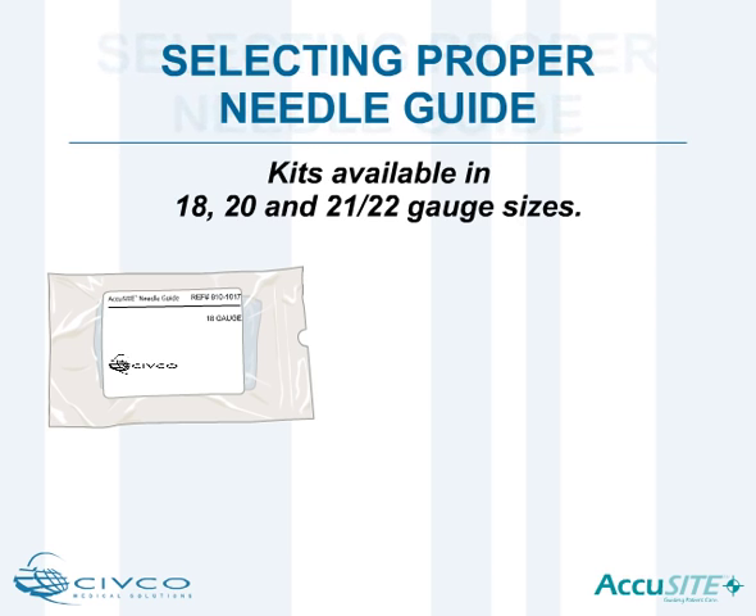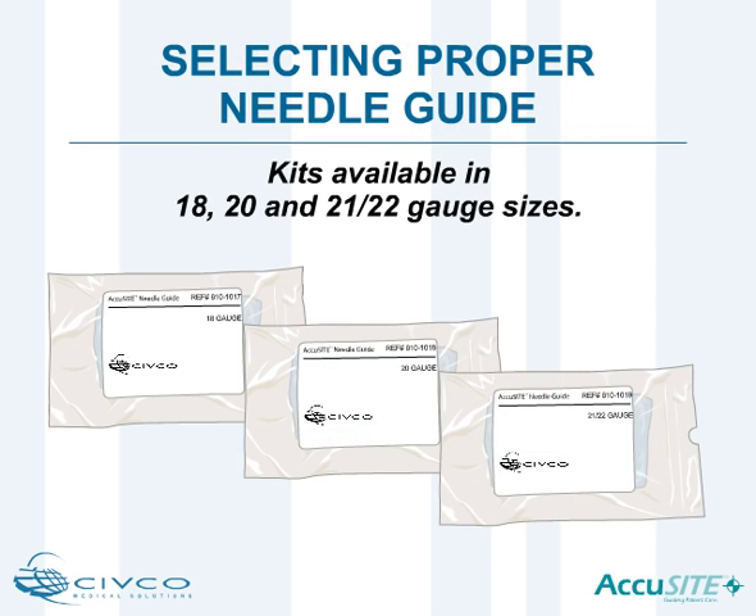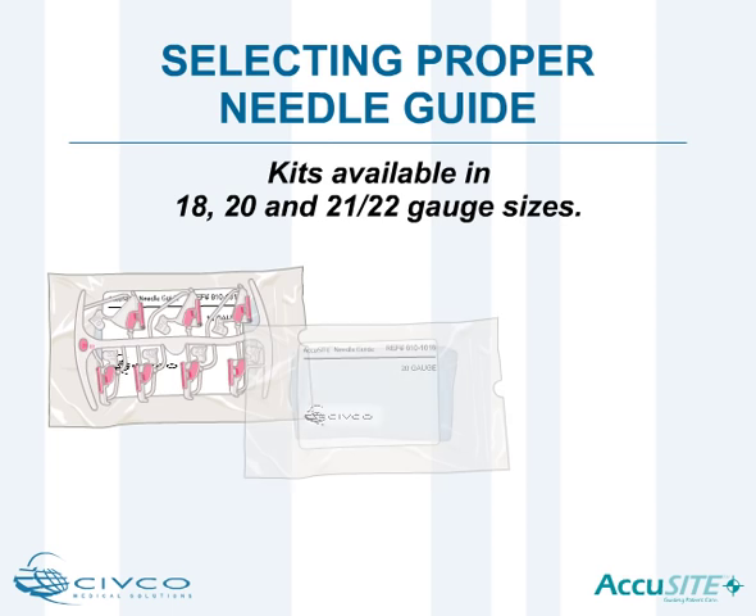AccuSight needle guides are conveniently packaged in a sterile procedure kit. Based on the type of line placement procedure, select the appropriate gauge size procedure kit. 18, 20, and 21-22 gauge kits are available.